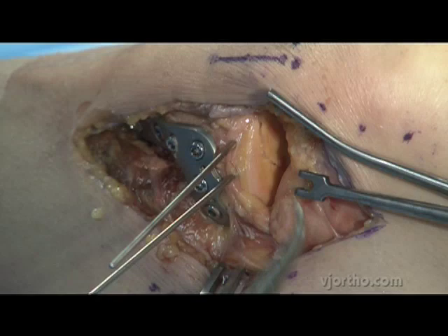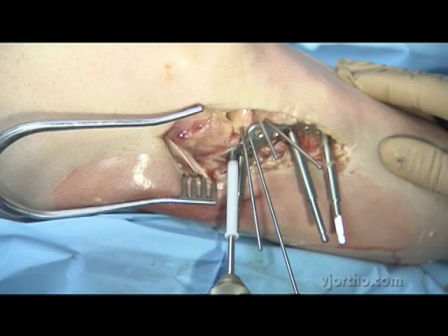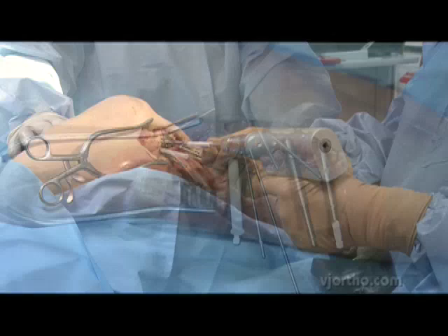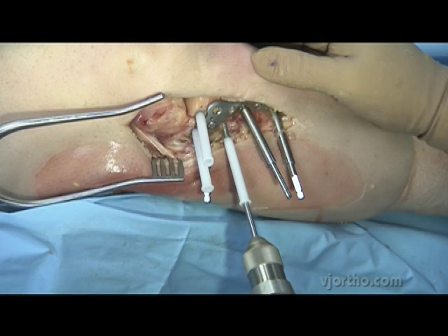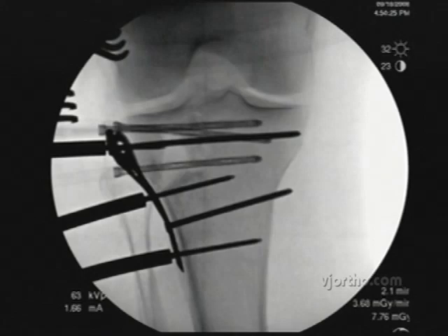A third technique is awaiting FDA approval and addresses one of our concerns: in the study, 9% of patients had some collapse even with the alpha-BSM cement. Looking back, the majority of those who had collapse had less than 5cc's of cement, and the speculation is that the cement wasn't adequate in volume or wasn't in the right place for optimum support. That research led to development of a new screw system to let the surgeon get the material in exactly the right place with exactly the right amount.